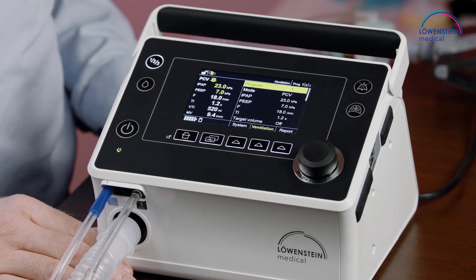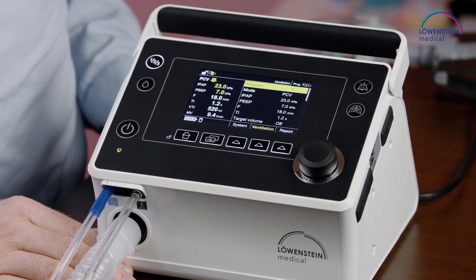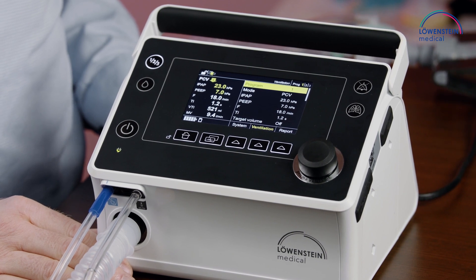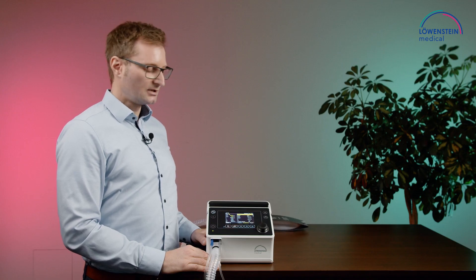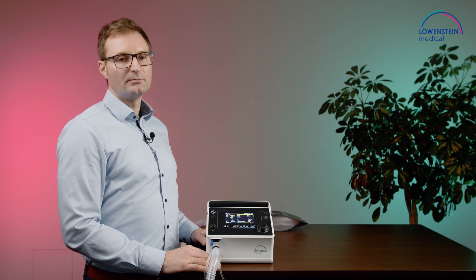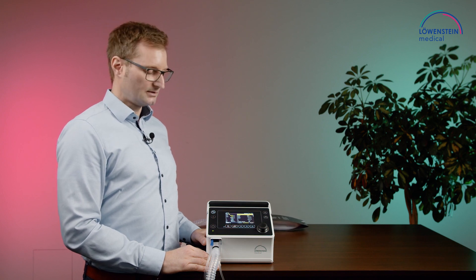In the ventilation menu, we can do all settings for the actual ventilation, like mode selection or pressure level selection. Further down in the menu, you will also find the alarm settings.